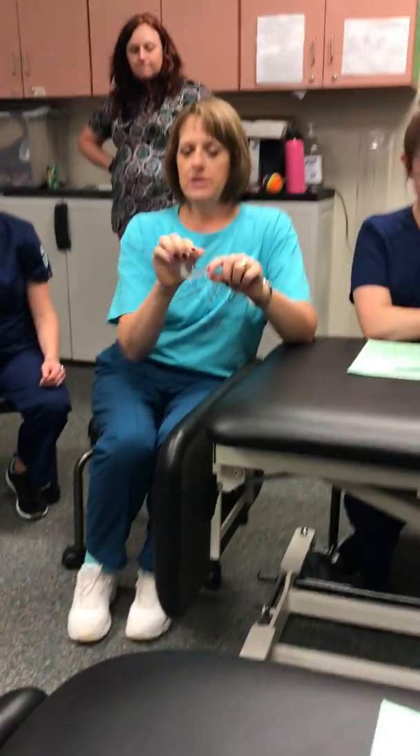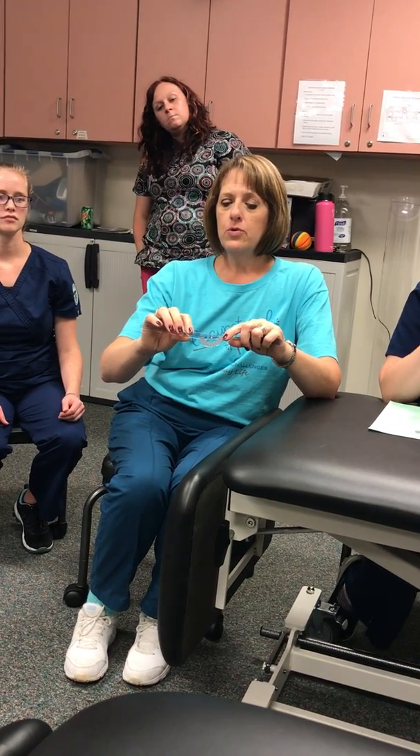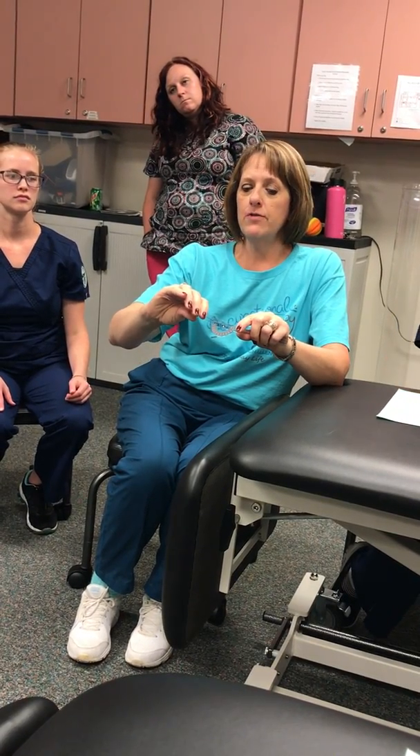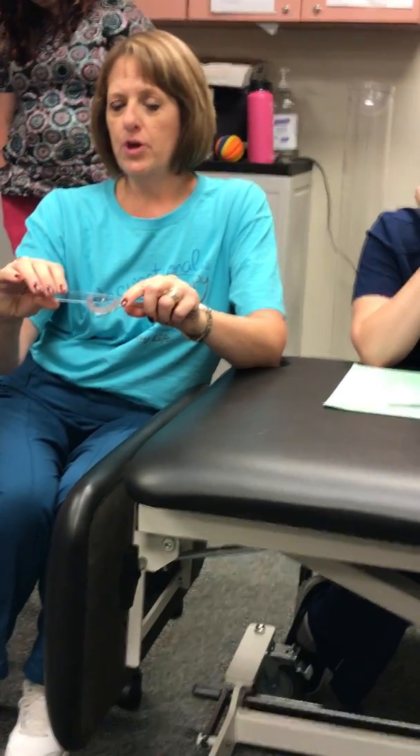You subtract 15 from your ending measurement. Wherever you end with flexion, you're going backwards because your numbers get smaller. So if you start at 15 and end at zero, you have 15 degrees of flexion. But if you go beyond that, you look at the other side of your protractor and add that to it.